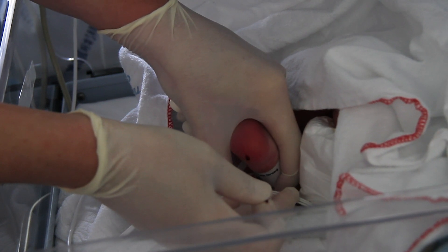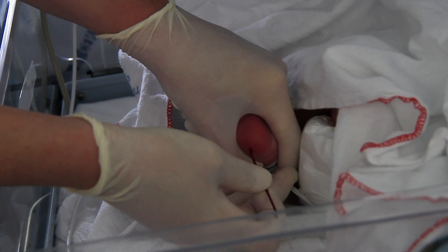If blood is not forming freely, very gently squeeze the lower leg and ankle.